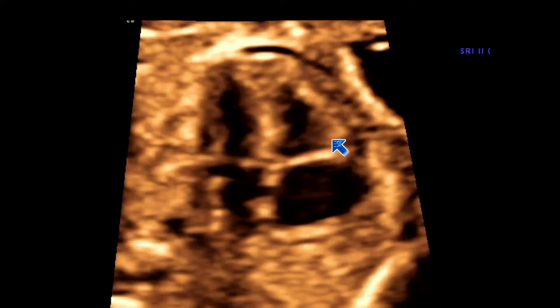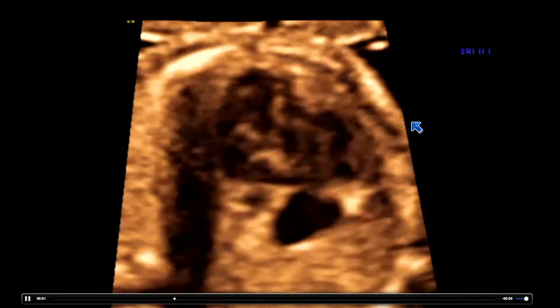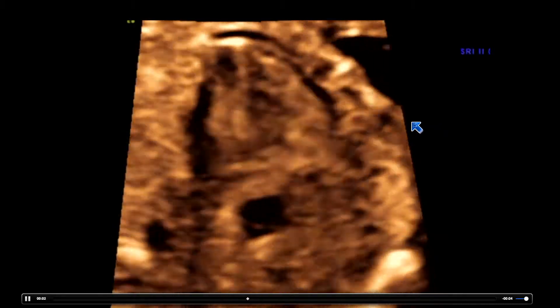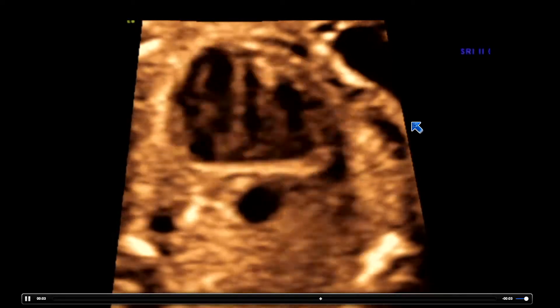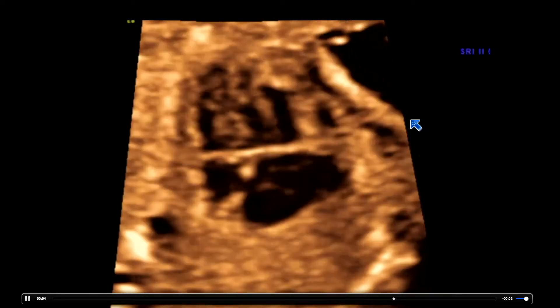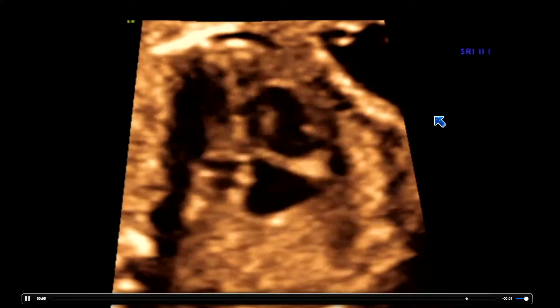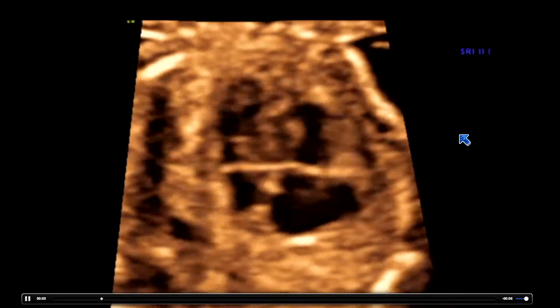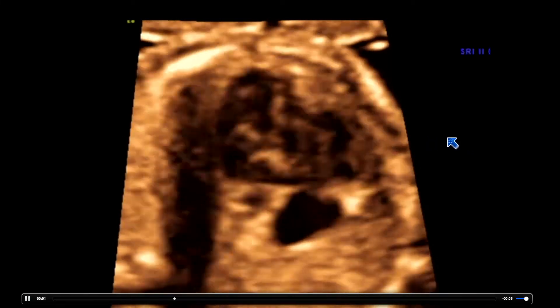Here again is a still image. If I get nothing across today, it's please save clips. We don't really see any offset of the AV valve here. But when I run it in motion, you can see it's a complete AV septal defect. So the lack of offset is the first clue in the still image.